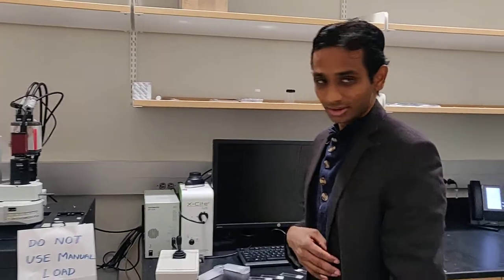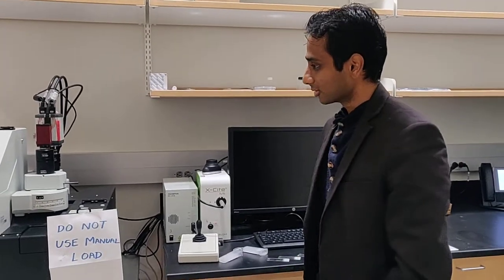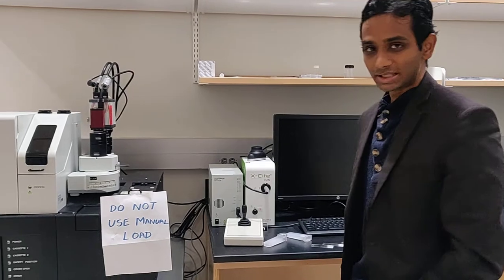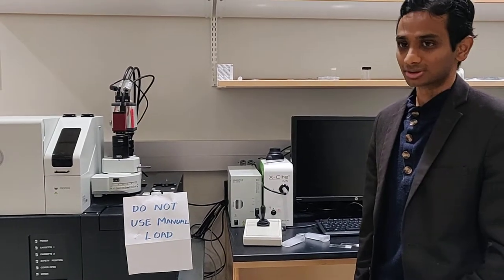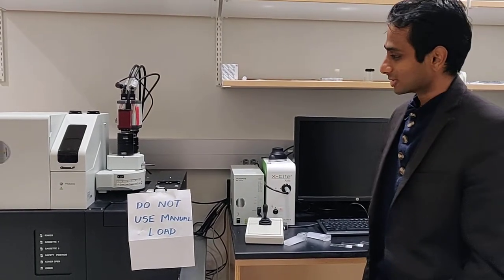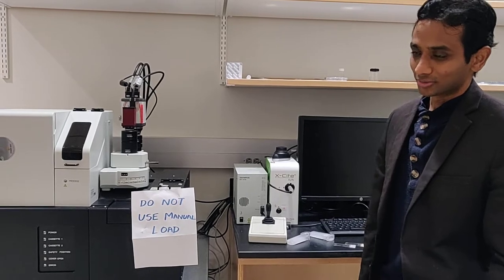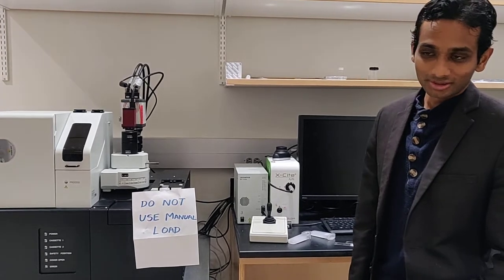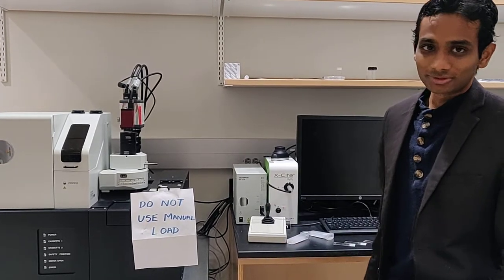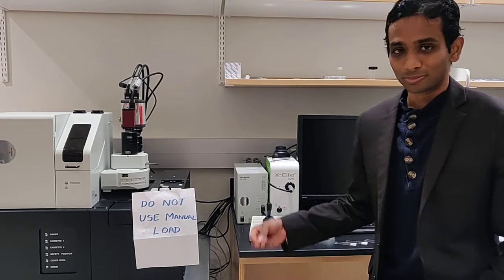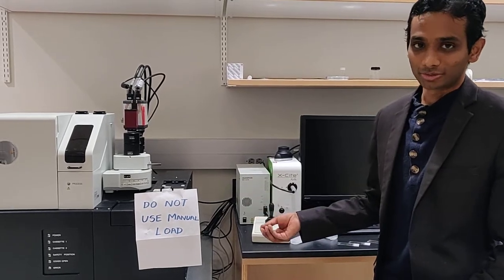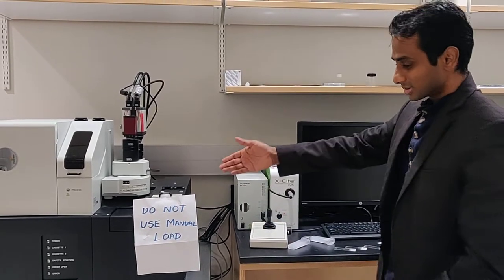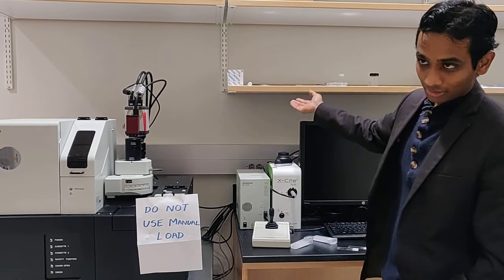Hi, today we are going to talk about how to use the slide scanner microscope. This is the workhorse of this facility because this is the most automated microscope that one can find, easiest one to use, and hence it's the most heavily booked microscope for the facility along with the confocal microscope.